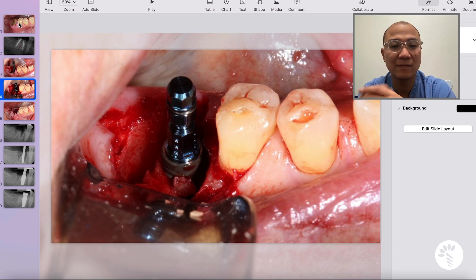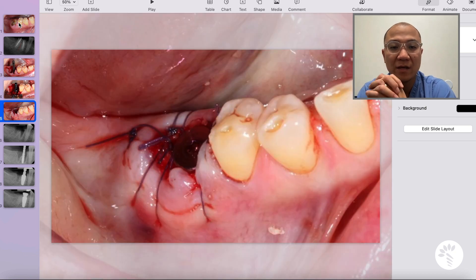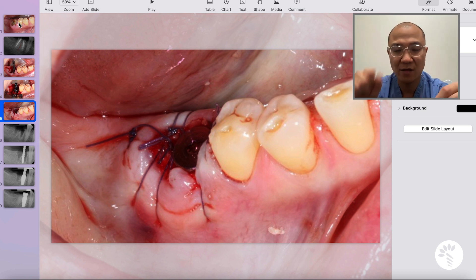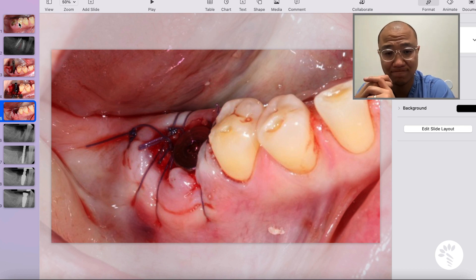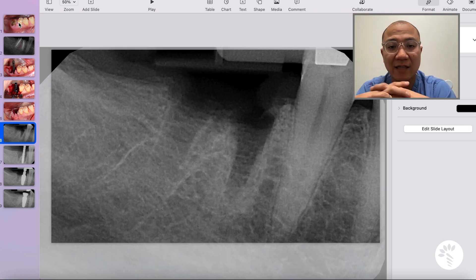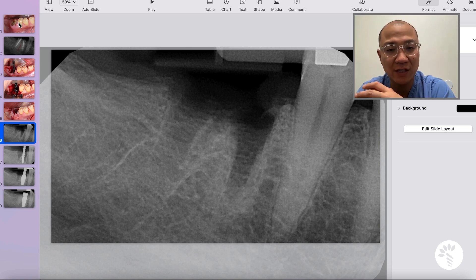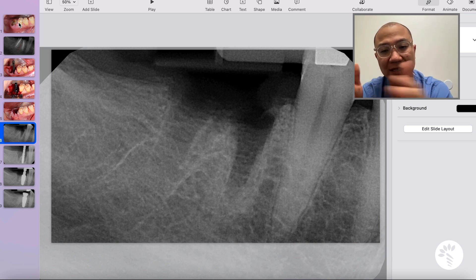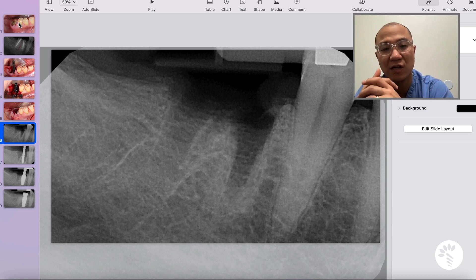After the implant was placed in a prosthetically driven position, bone graft was placed and a healing abutment was chosen, then the flaps were approximated together using stitches. This is the periapical radiograph right after the extraction. You can clearly see there is good septal bone that I can engage with the distal part of my implant, which is going to go close to the mesial socket.